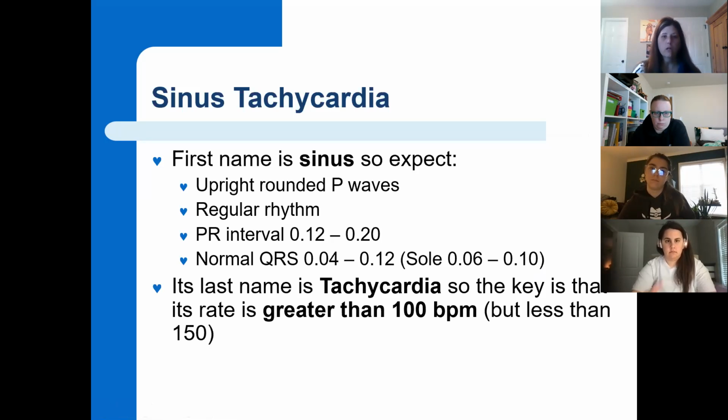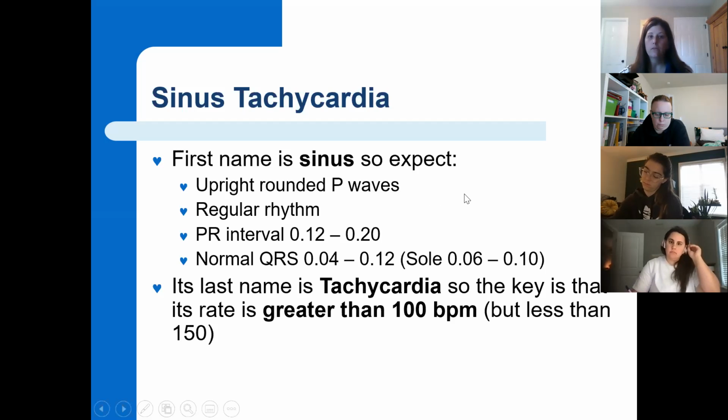Okay, so now we're going to go into sinus tachycardia. Okay, yesterday was sinus bradycardia. It was slow. Today is sinus tachycardia. So the last name, again, the first name is sinus.